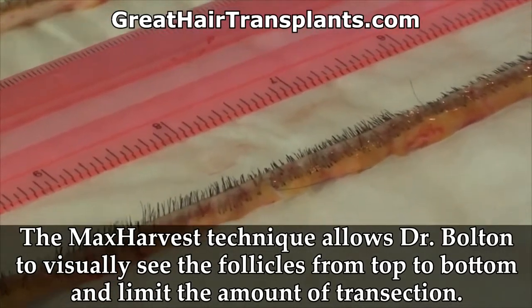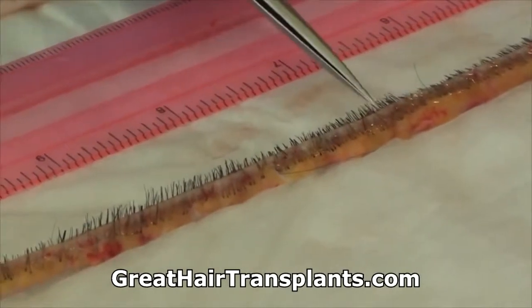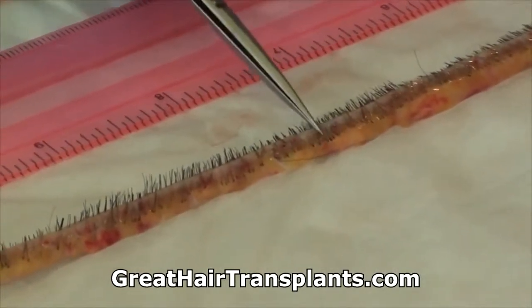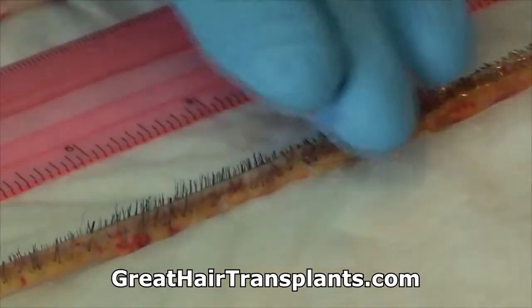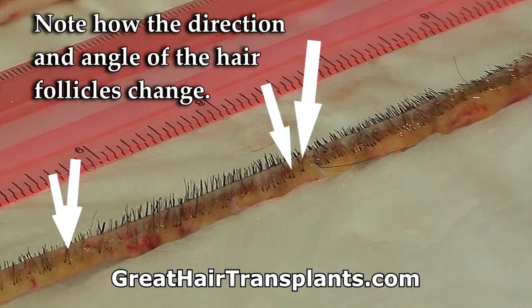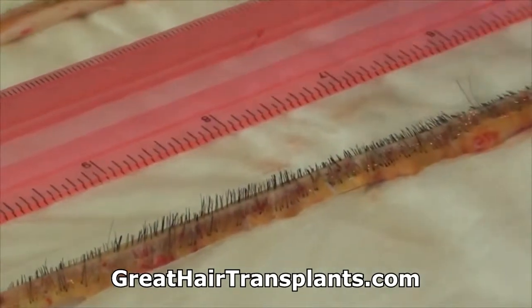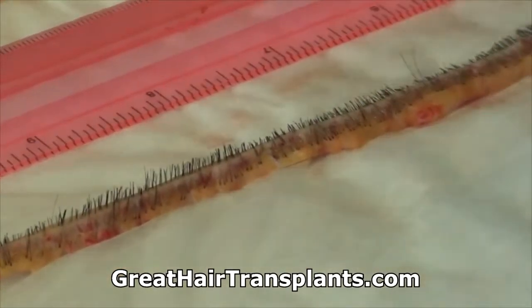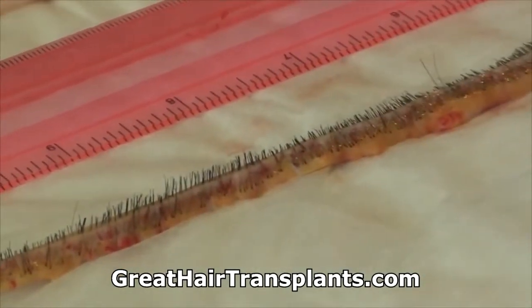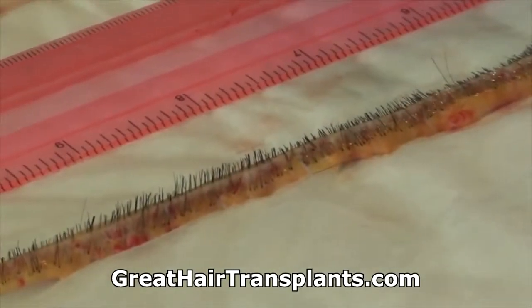which makes it so much easier to get more viable tissue. Then my team will take this and harvest the follicles out of here with magnification. So they're going to be able to see exactly what's going on. It's not going to be me taking this blindly from behind and trying to punch this out without being able to see the angle. Now I can see everything. It's opening it up and looking under the hood versus trying to work through the cracks of your car trying to fix your engine. That's what you're doing here.